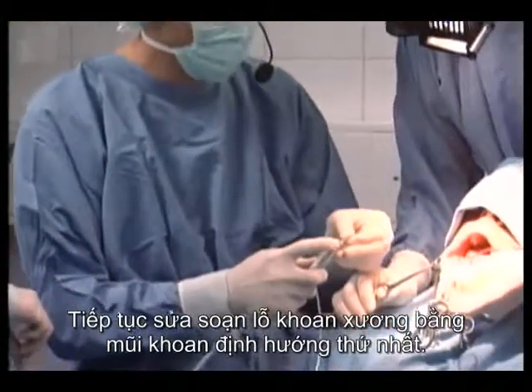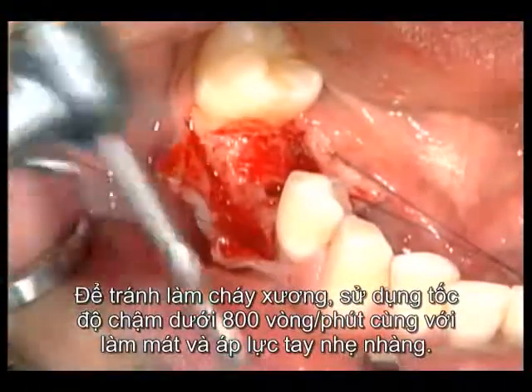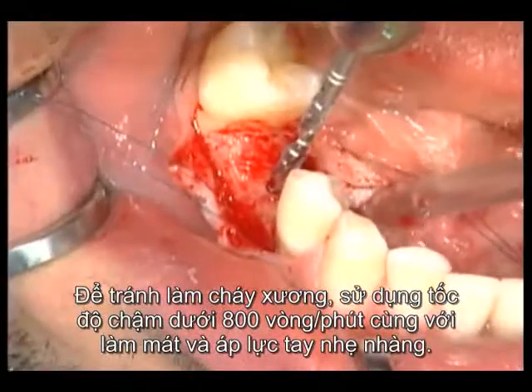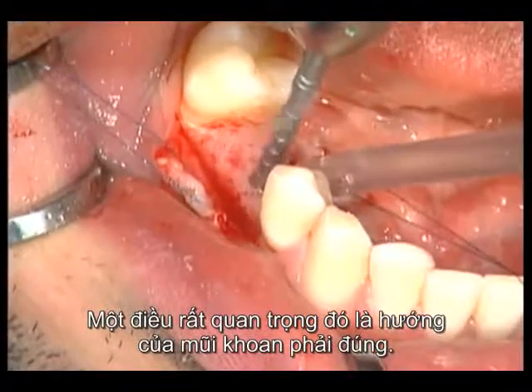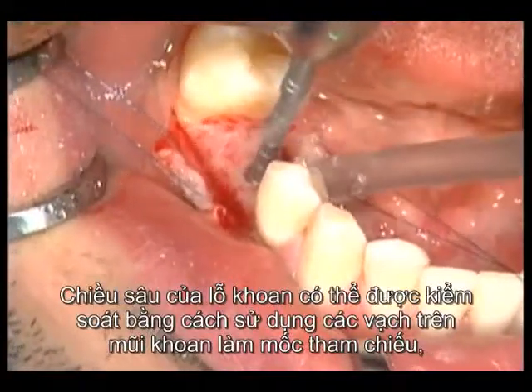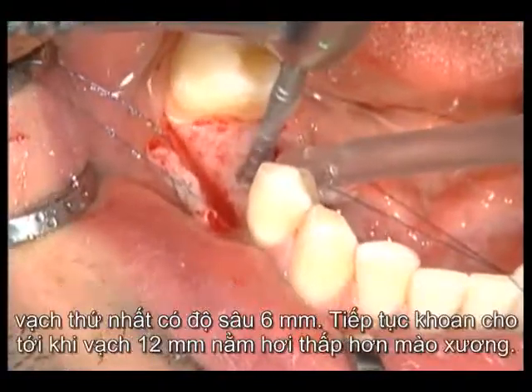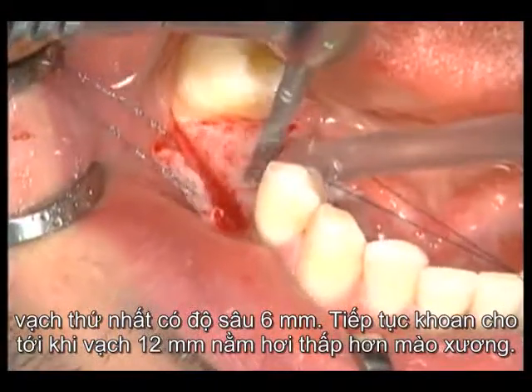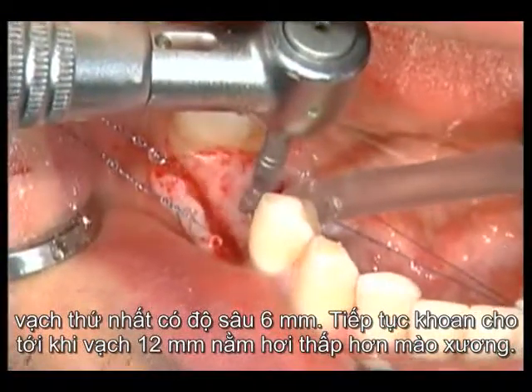The site preparation continues with the first pilot drill. To avoid overheating the bone, a reduced speed of lower than 800 RPM is used, with ample cooling and light hand pressure. It's especially important that the direction of the drill be correct. The preparation depth can be controlled using the markings on the drill as reference lines. The first line is at 6 millimeters. Preparation continues until the 12 millimeter line is located slightly below the bone crest.